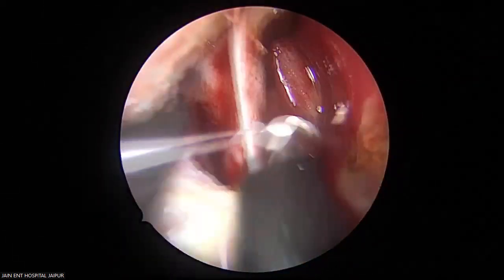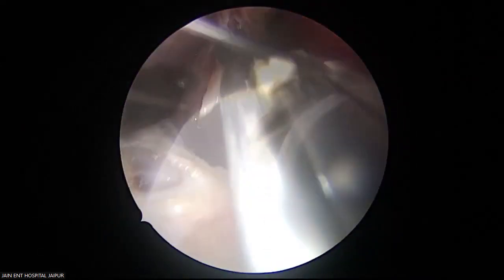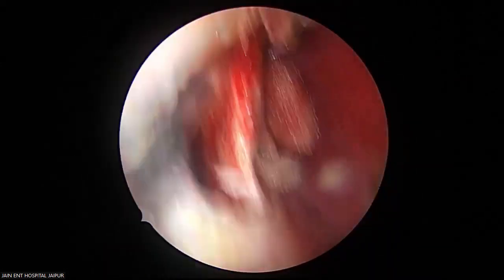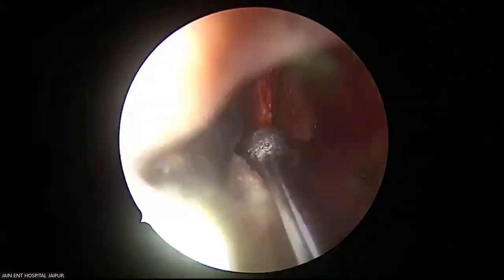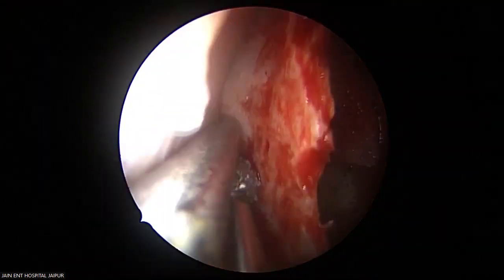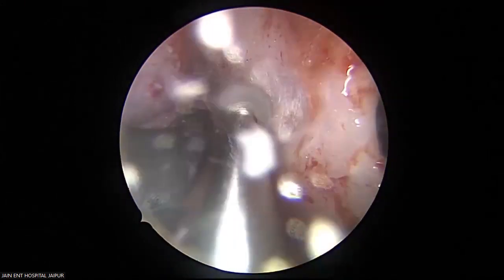See, now this part of the bone I have exposed has to go. And this way we will reach head on into the maxillary sinus. So this thin bone anteriorly I can punch out. The rest I have to drill, or you can use a chisel and hammer. So if I drill here, I will be right into the maxillary sinus head on. See this. And then I will show you how much bone is to be removed superiorly, laterally, everywhere under vision.